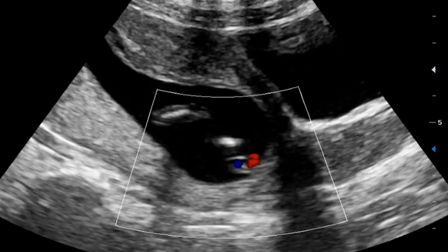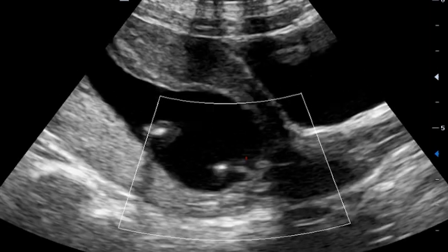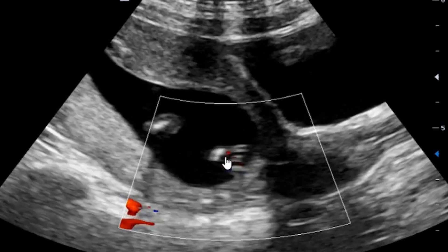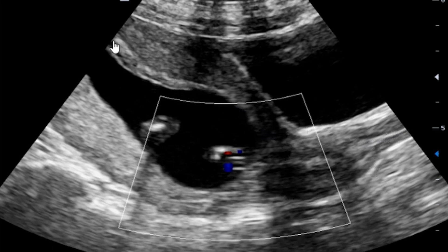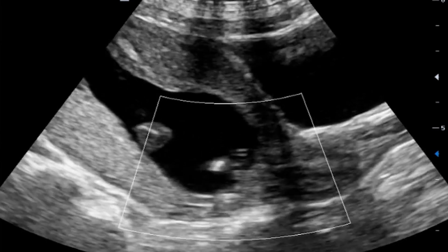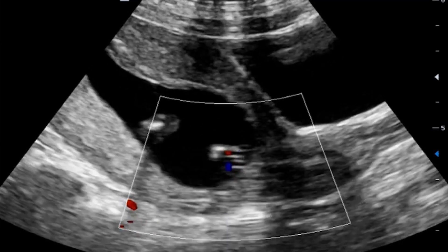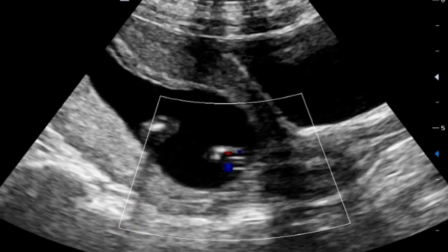You can appreciate vasa previa here — you can see the blood vessels there. This is our endocervix, this is the cervix, the vaginal canal is there, and you can appreciate our uterus nicely. The blood vessels are visible here — this is a classical, typical case of vasa previa.